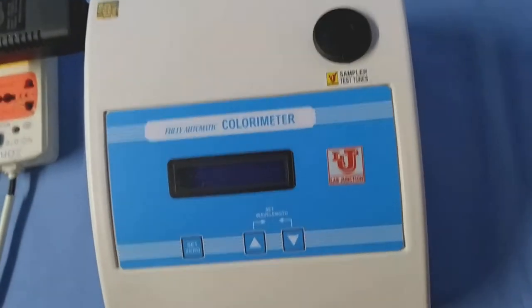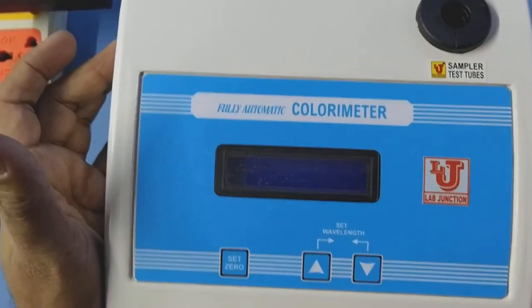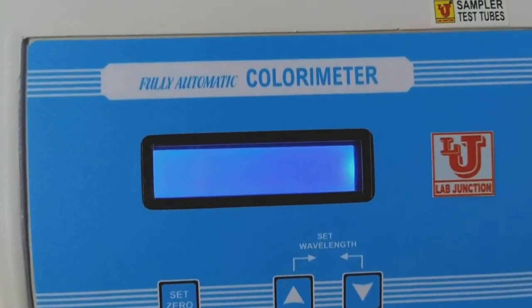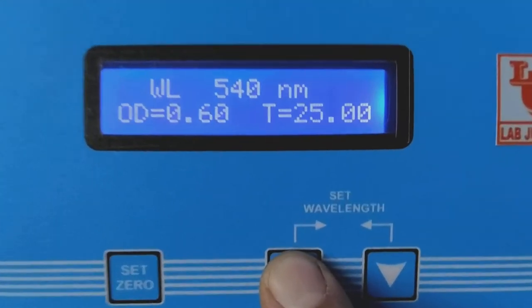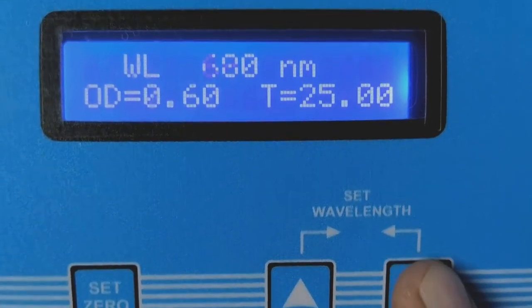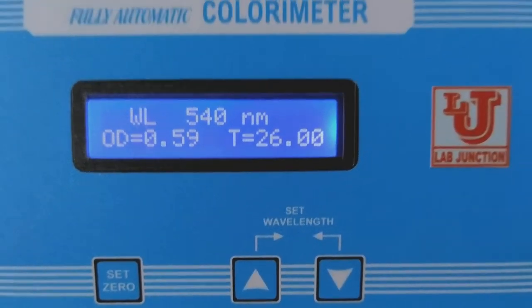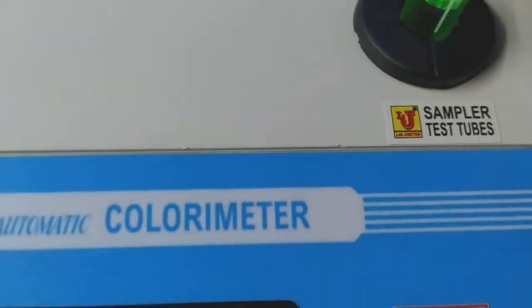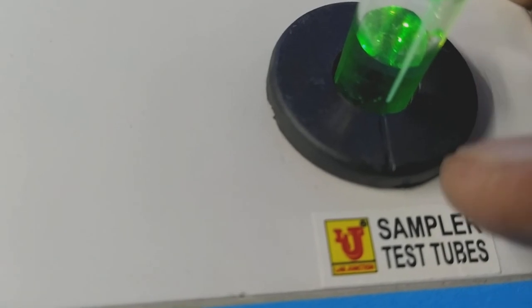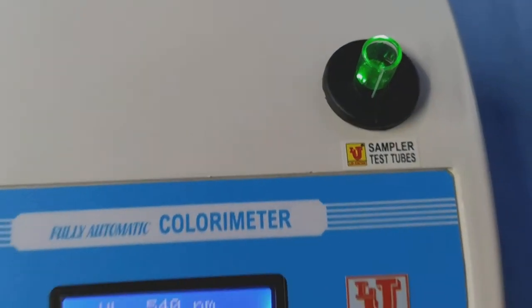Now I am doing glucose test from this colorimeter. You have to switch on the machine, colorimeter. First, you have to set your wavelength this way. I am setting it to 540 nm. Now, insert test tube like this. Please coincide the test tube mark with this mark like this, and completely insert, and press set 0.